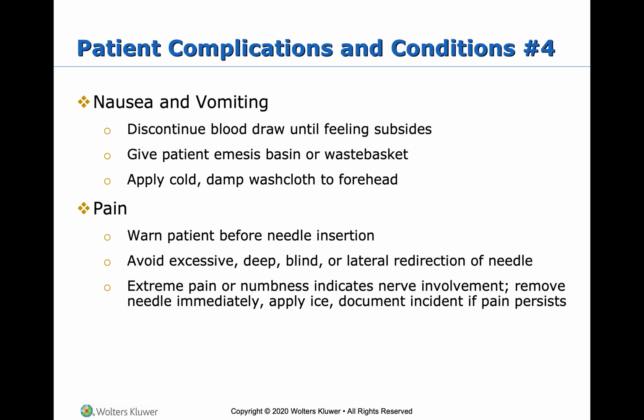Obviously, it says avoid: you never want to excessively probe, what we call fishing in the phlebotomy world, where you're poking around blindly trying to find a vein. If you poke into the skin and you're not getting blood flow, you can repalpate above the needle and feel, okay, I'm just left of the vein. I can redirect.